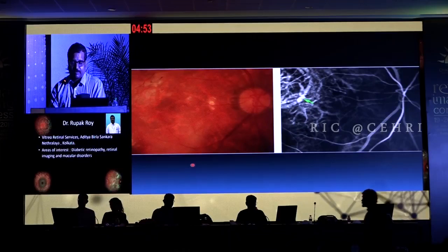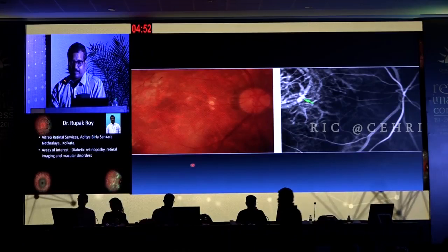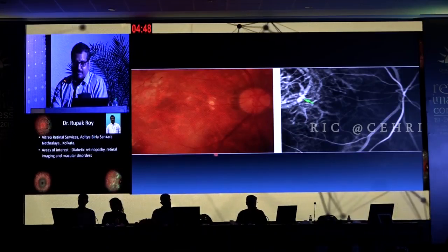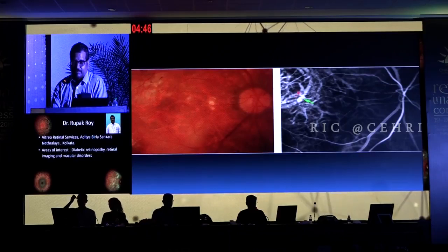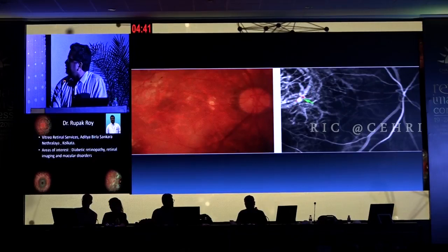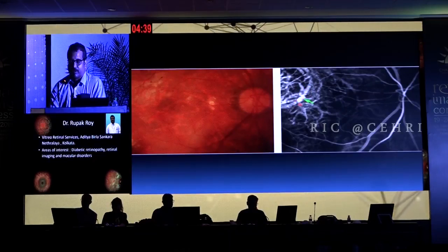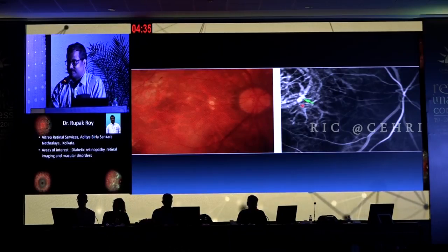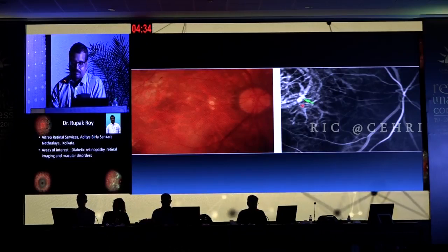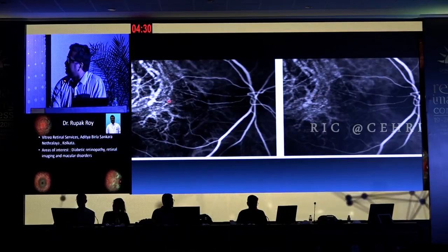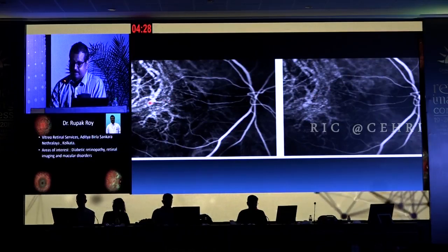In another report, the green arrow shows a sudden change in the course of the choroidal vessel. This is basically what is known as a choroidal knuckle — a choroidal vessel coming and then going up, and the bulb-like structure it forms gives the appearance of a hotspot. This can be misdiagnosed as a polyp. In the same patient, you can also see the termination of the vessels.